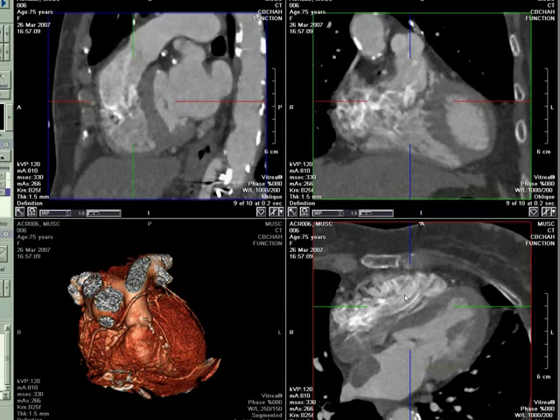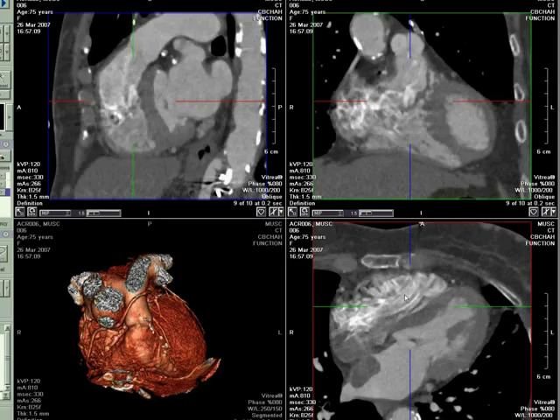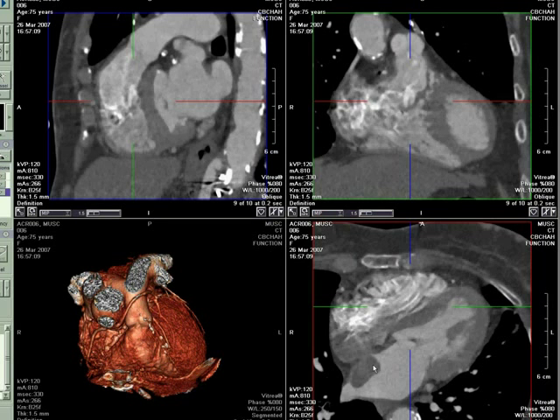A 75-year-old female was referred for a cardiac CT after a transthoracic echocardiogram showed a possible left atrial mass. The goal of the coronary CTA was to show the relationship of the mass to the adjacent structures, in particular the atrium and the pulmonary veins, and also to try to characterize the possible movement of the mass.